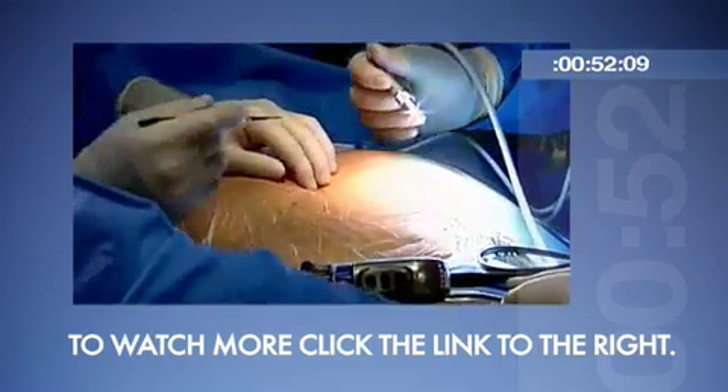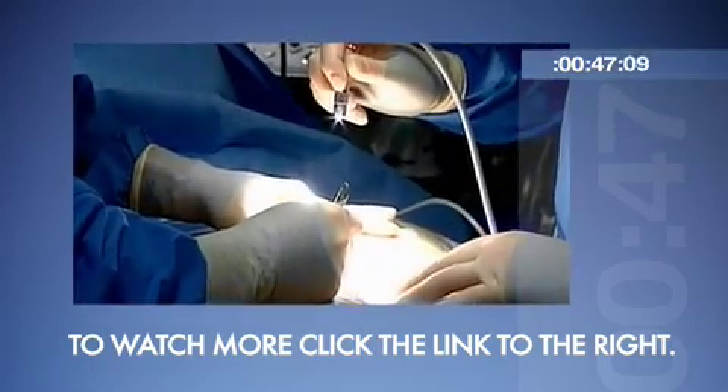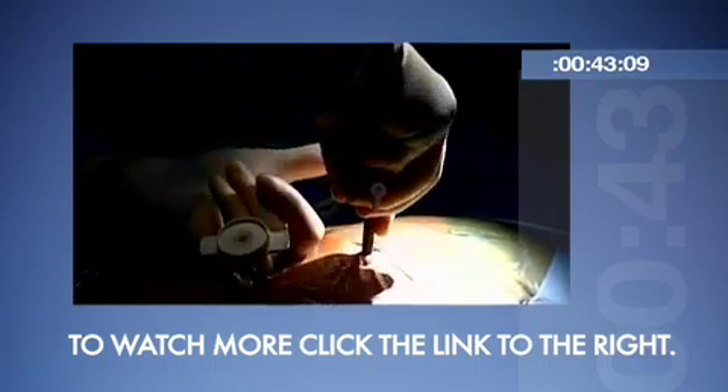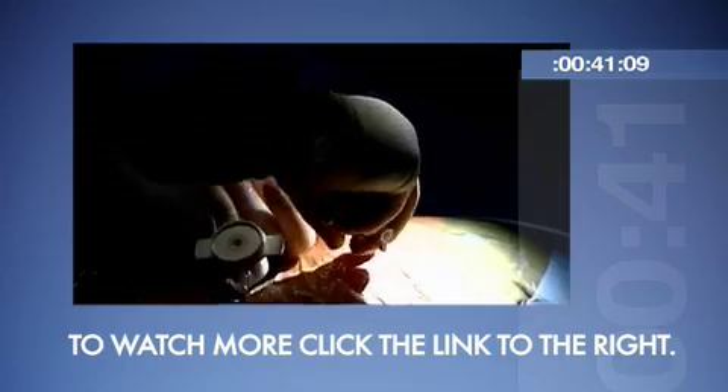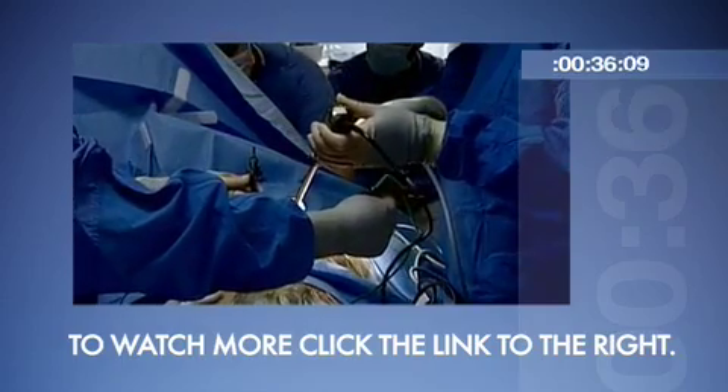As I've said earlier, we make a small incision just beneath the breastbone. That incision is then extended into the abdomen and I can insert my finger into the abdomen and place these small trochars into the abdomen, which allow me to place instruments that I can then use to operate on the diaphragm and operate on the heart.